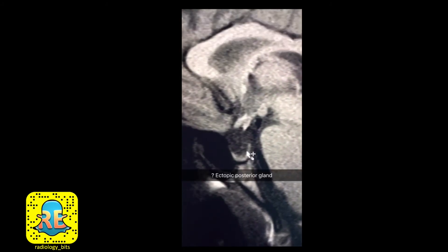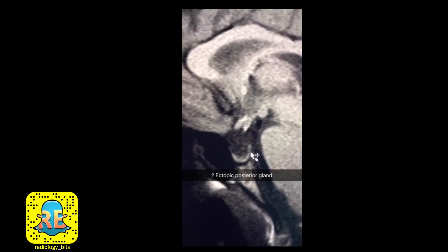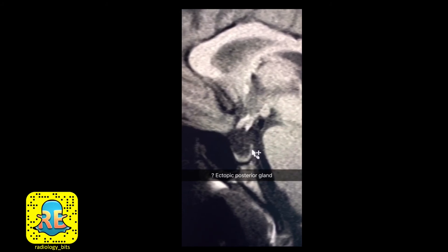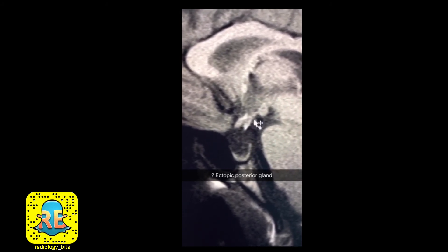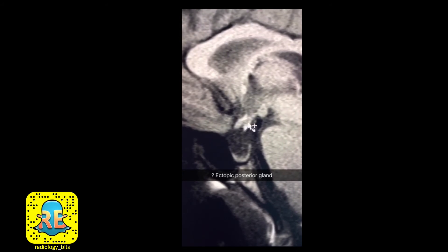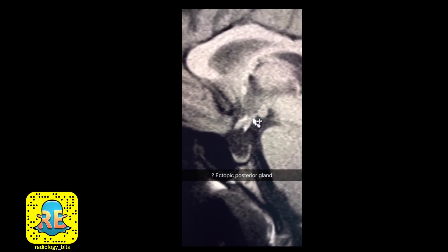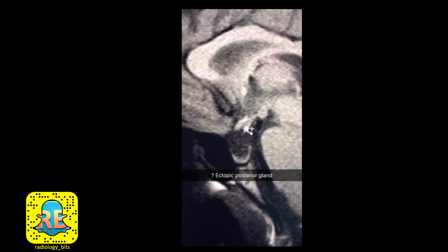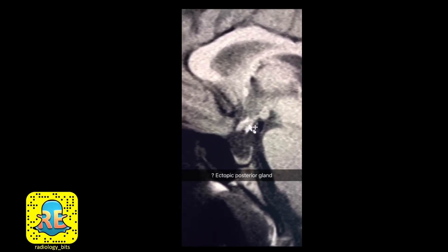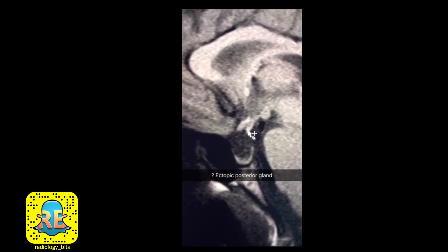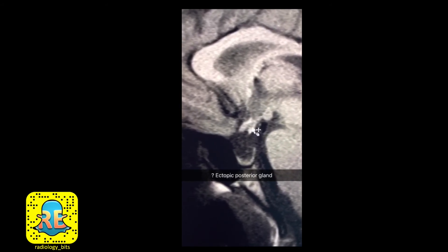If you don't see the posterior pituitary gland in its normal location, you have to look for it elsewhere — it could be ectopic. One possible location is here, where it could be sticking to the floor of the third ventricle, very close to the tuber cinereum. There is a bright spot in this location, which could represent an ectopic posterior pituitary gland.